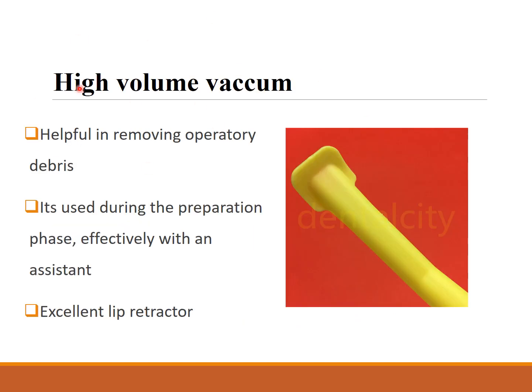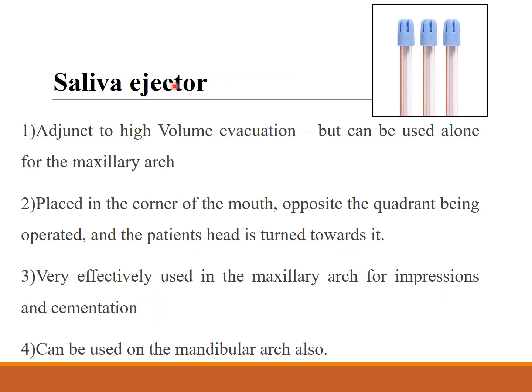Okay, so high volume vacuum. These are suction tips which can be helpful for removing operatory debris. It's useful in the preparation phase, effectively with an assistant, and also an excellent lip retractor.